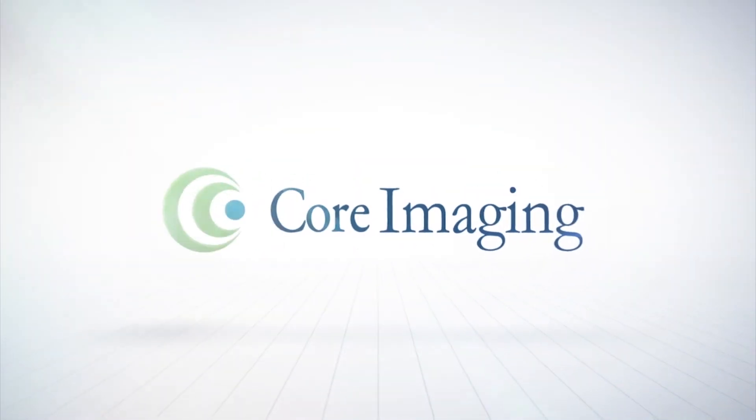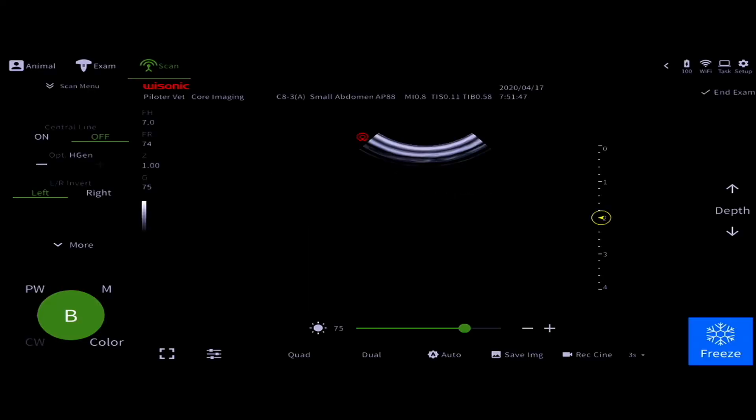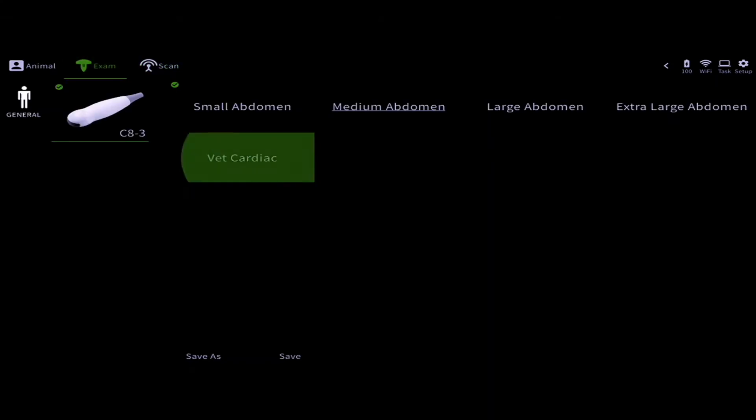Welcome to the Piloter learning series. In this video, we'll show you basic M-Mode operations. From your scan screen, go into your presets and choose VET Cardiac.